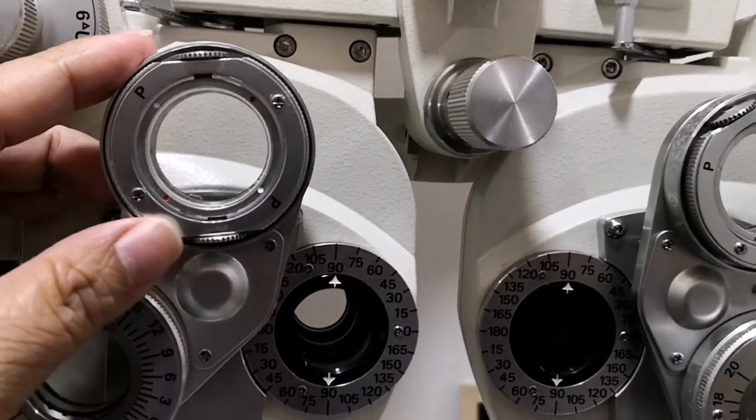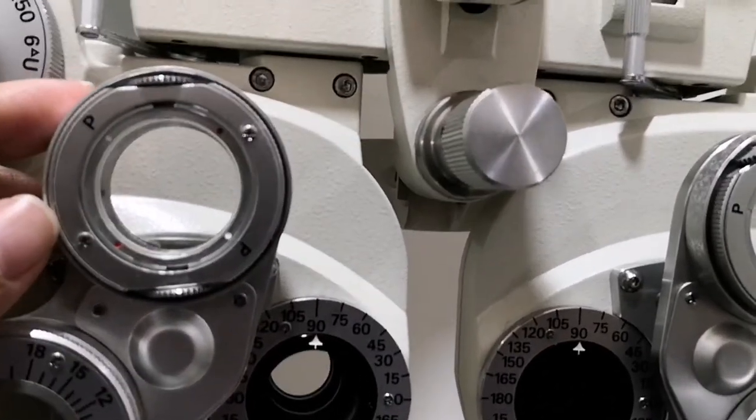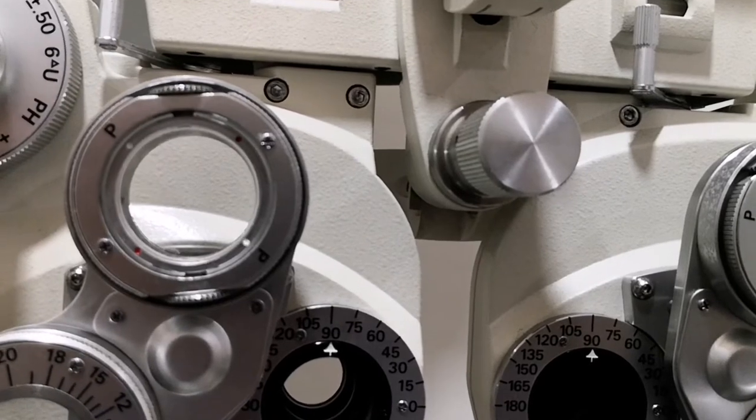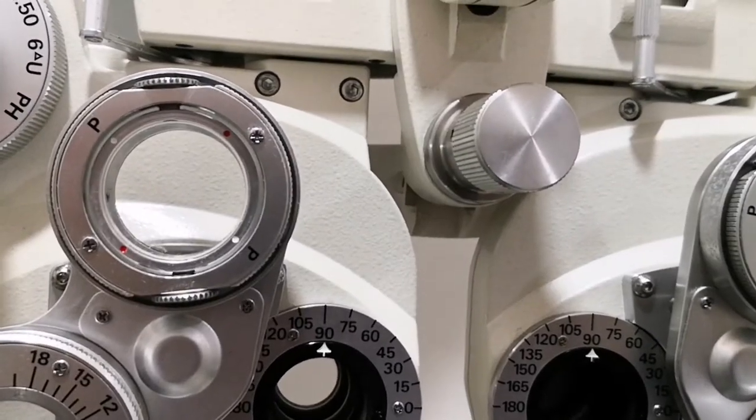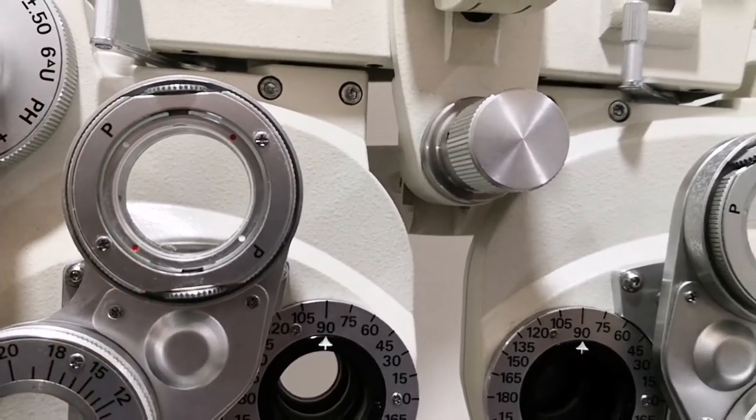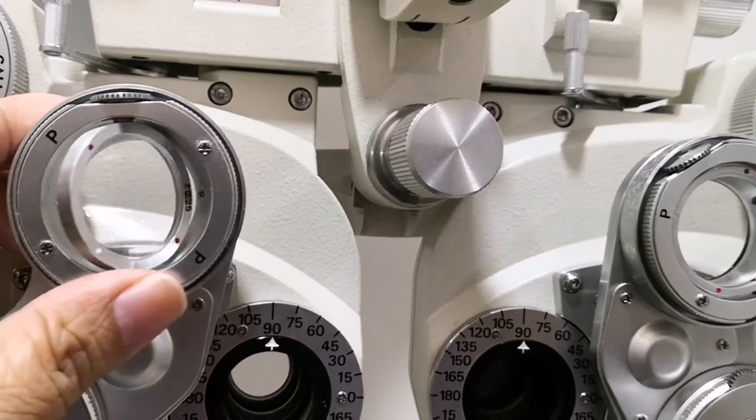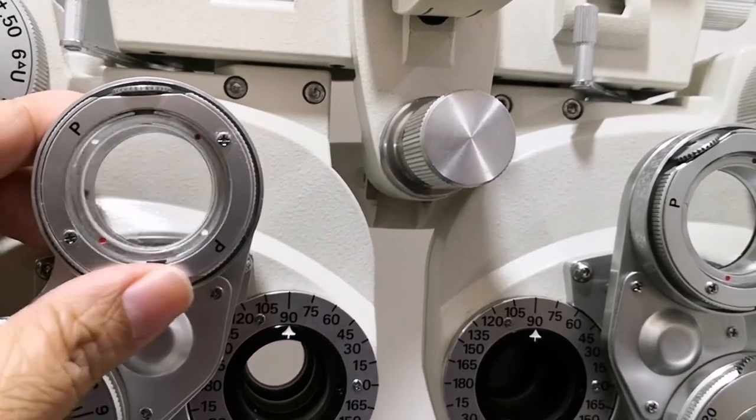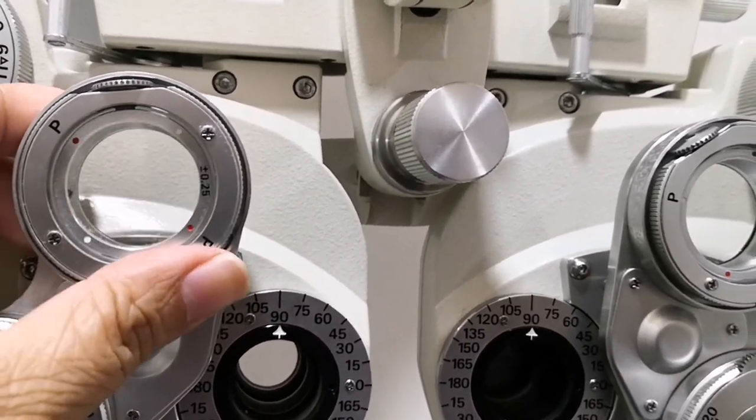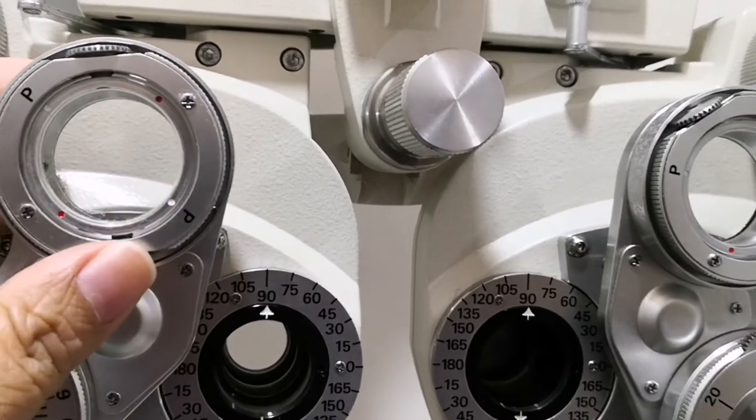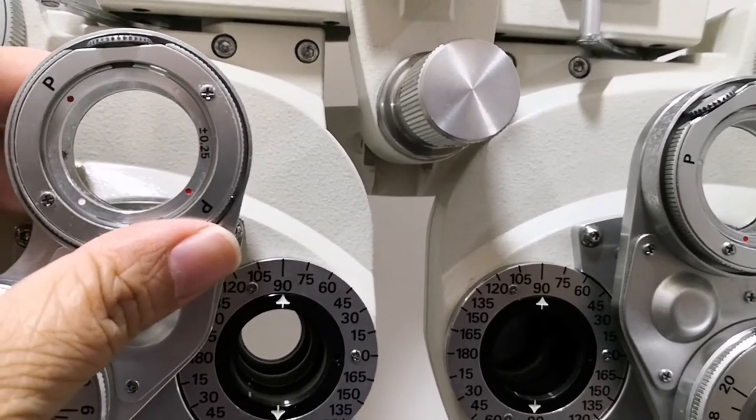Next, we have the Jackson cross cylinder or the JCC. It is marked with red and white dots, but for other phoropters it can also be a green dot. You can flip it over and it is useful in confirming the cylinder axis and cylinder amount of the patient.